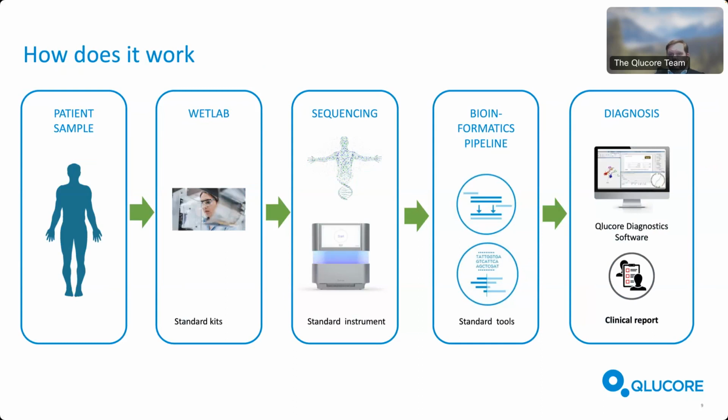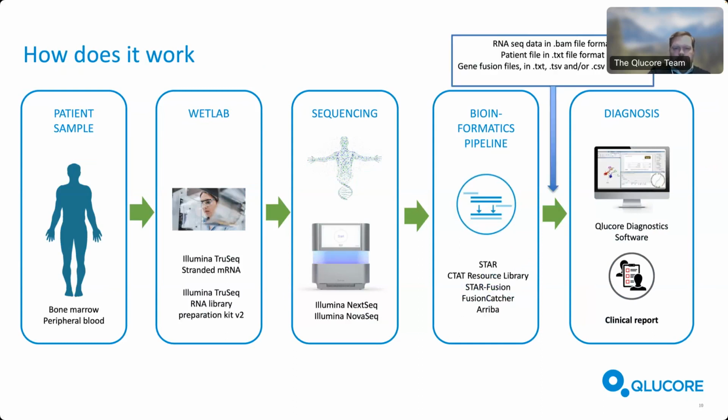Sounds easy enough. Now, if we have a little bit of a closer look so that you will get a feel for what's actually going on and what you need to do in order to utilize our software, I have added some more information to the slide, and we can go through it in a little bit more detail. I use the BCP ALL model here as an example, but the procedure is very similar between models.